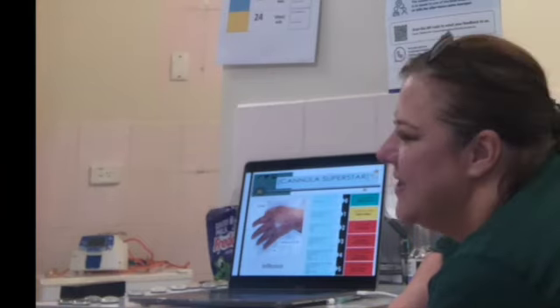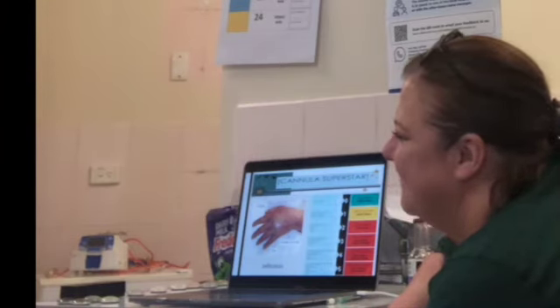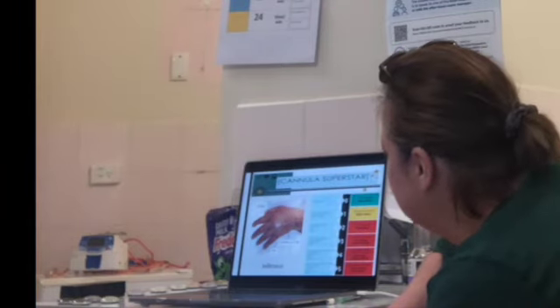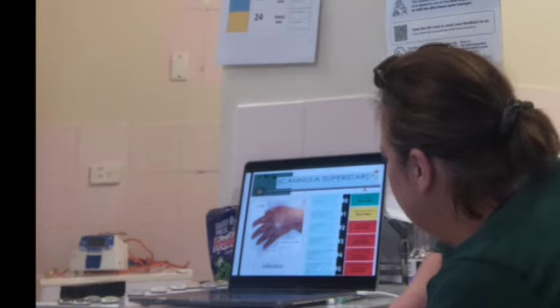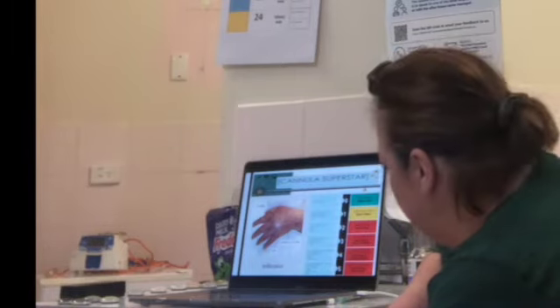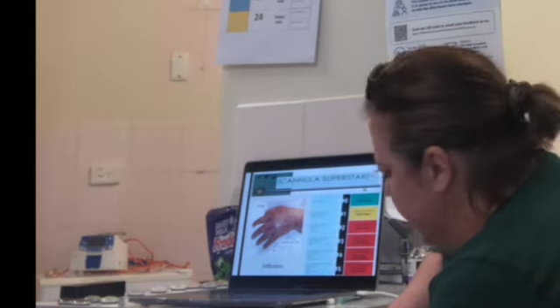And because we're cannula superstars, none of our patients are going to have a VIP score of 4 or 5. She might be getting that from another hospital. Not to blame the other hospital, but if they've travelled from over the mountains, by the time they get to you, that's the difference between a 3 and a 4. You have to have a palpable venous cord and all of the other symptoms.